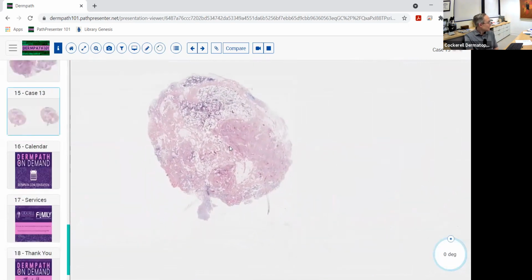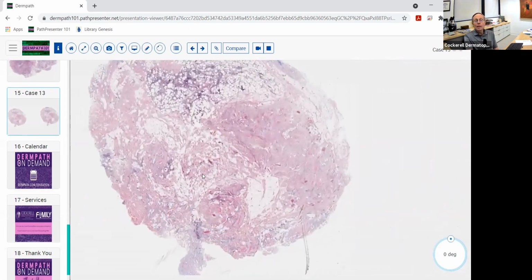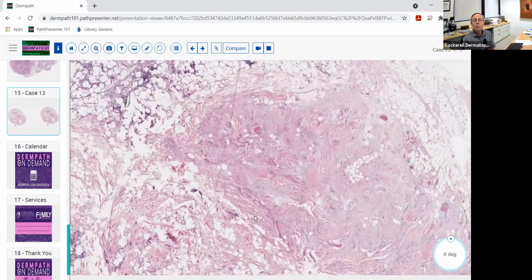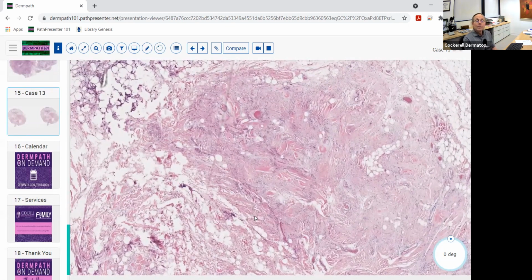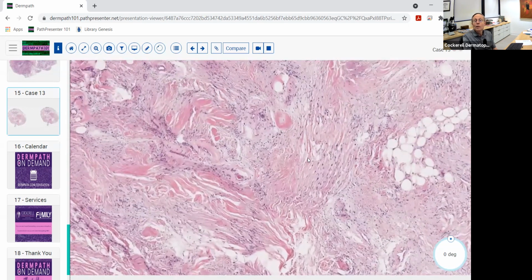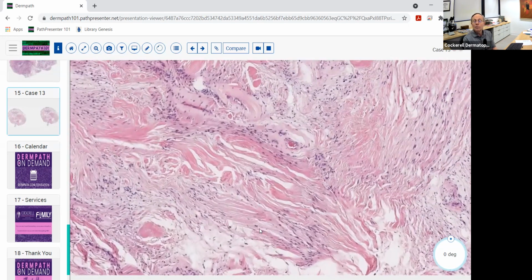This last one is a true garden variety liposarcoma. Now, there's several different types of liposarcomas. Just so you'll know, the soft tissue pathologists are always looking to rename things. Years ago, they used to call a lot of these soft tissue neoplasms subcutaneous fat that had spindle cells, like you see here. They were frankly atypical with mitotic figures and whatnot in them. They would call a lot of these liposarcomas.